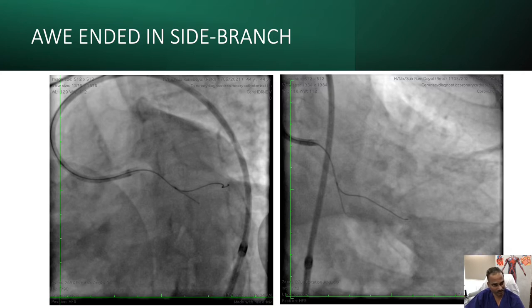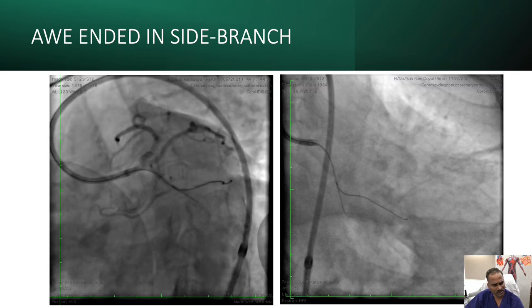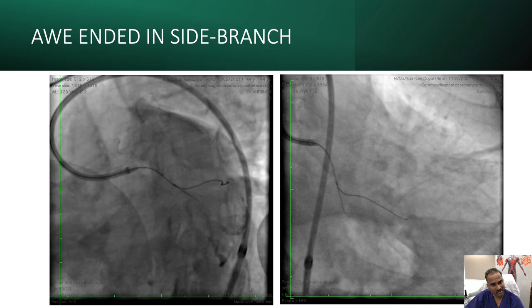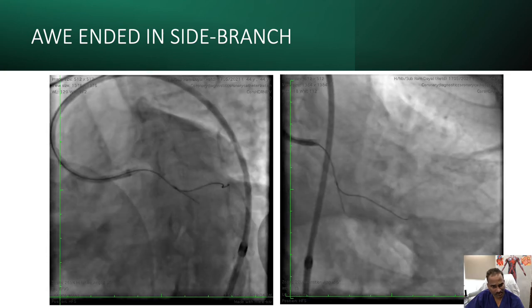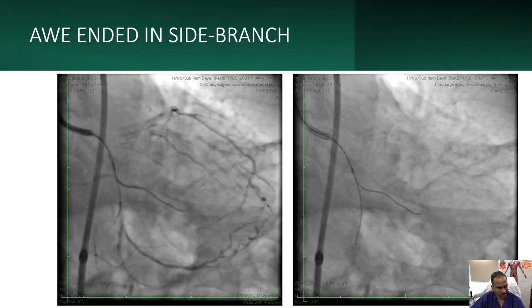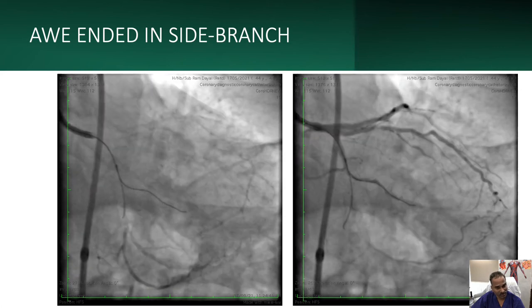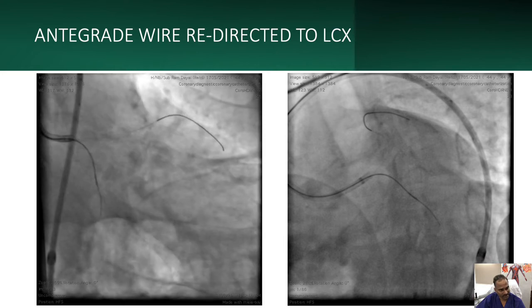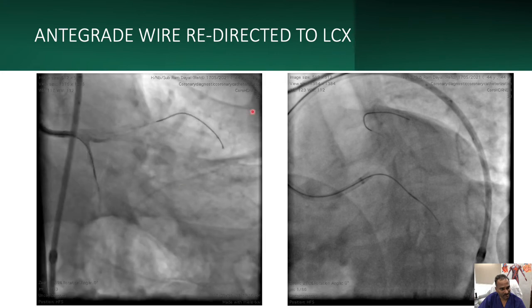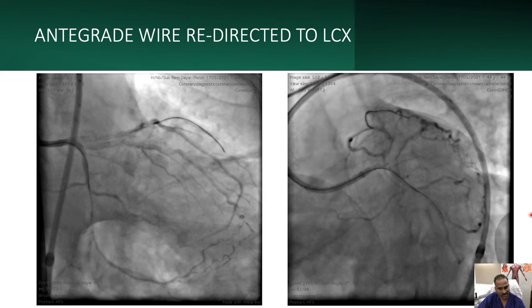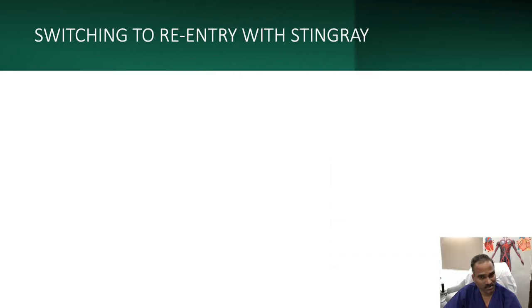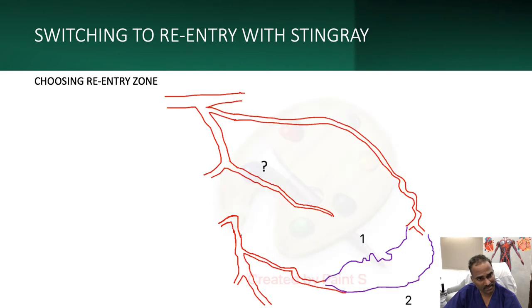Due to the patient's ischemia, I wanted to complete the case fast. The wire subsequently went into a side branch. Since I was unsure whether it had achieved intimal entry and the wire had gone into a side branch, the next challenge was redirecting it into the main LCX. We performed redirection using two orthogonal views. The wire came into the LCX but appeared clearly sub-intimal, so we decided to switch to Stingray re-entry.